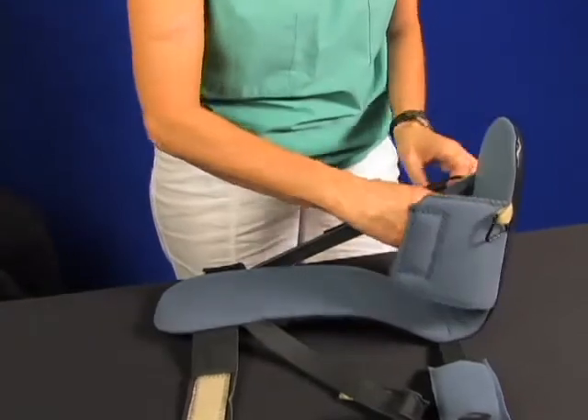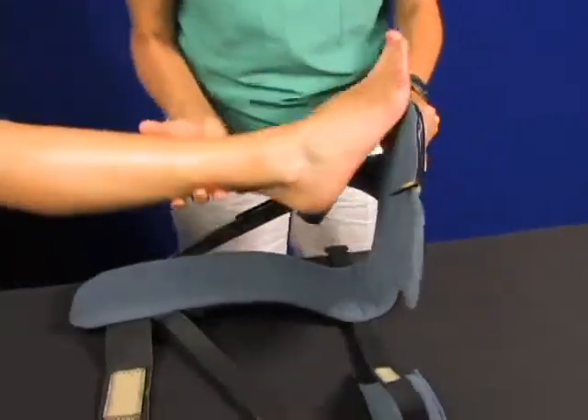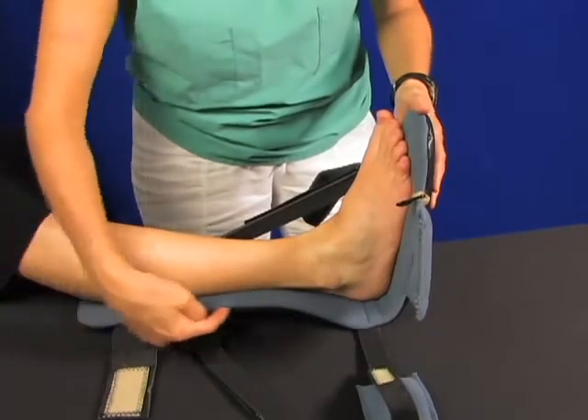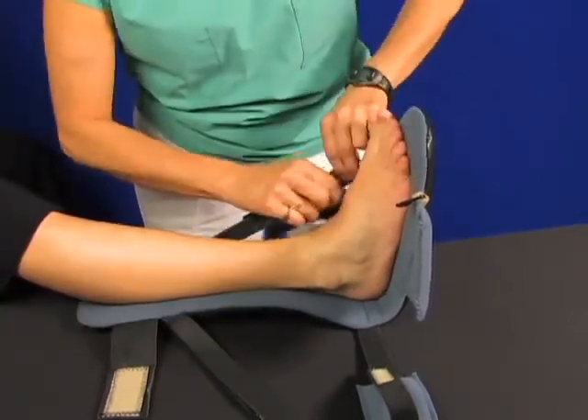You can fold the hook back onto the strap temporarily. Then open the foot cover and place the foot into the boot. It's already been shaped and sized appropriately, which we will address later in the video. Note the curve behind the Achilles tendon and the curved heel area used to float the heel if desired.